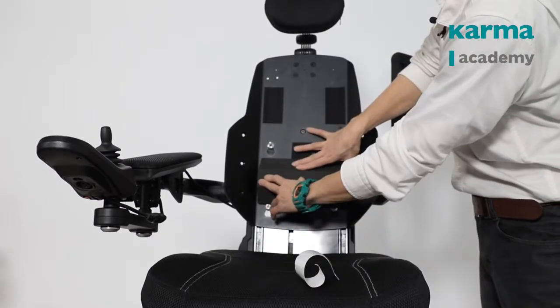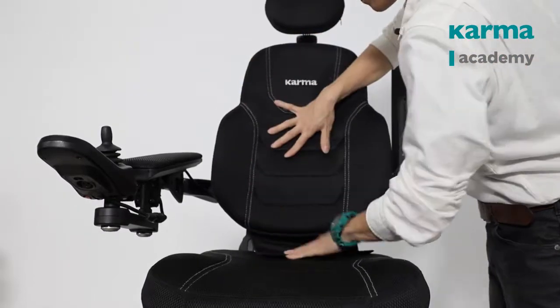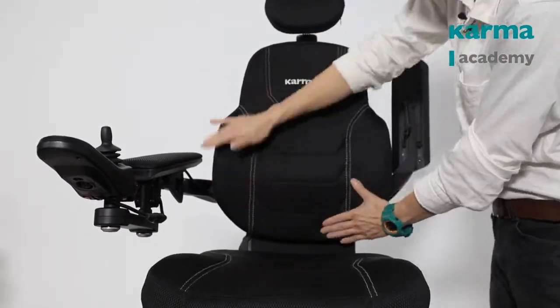Put the lumbar support to the ideal position and mount the backrest cushion back. Now the user will have an extra support at the lumbar.